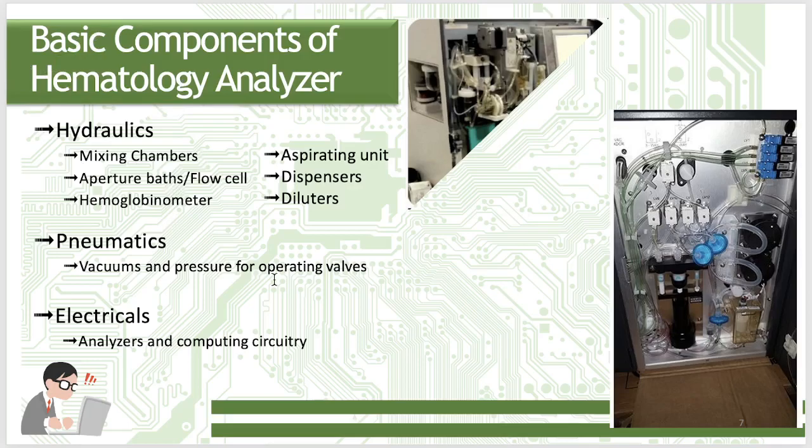May mga times nga, guys, na ang tagal talaga mag-reply ng engineer. So, ang ginagawa namin, gina-check namin ito, isa-isa, asan kaya? Parang kasi mag-flag siya na may clog sa particular na area. So, tinitingnan namin. May times kasi yung mga engineers, tinitingnan din namin kung anong ginagawa nila para at least if ever may ganun pa rin na error, at least alam na namin kung ano nang gagawin. So, but still, you have to contact the assigned personnel, no, to perform that one. Kasi remember, the machine is very expensive, millions. Makakasira ka, patay. Makakabayad ka ng million.